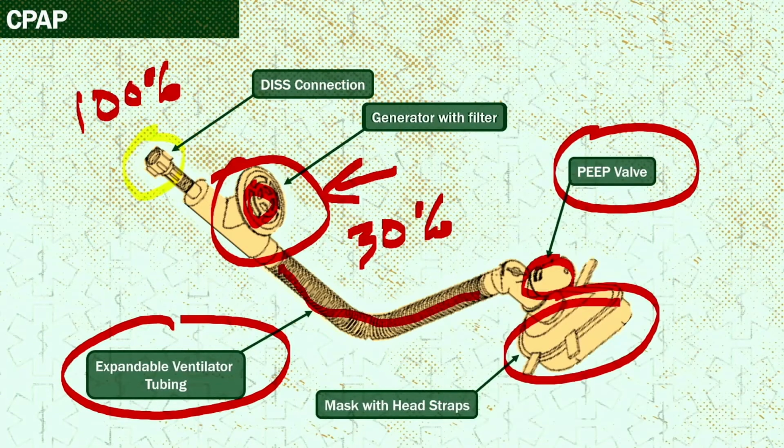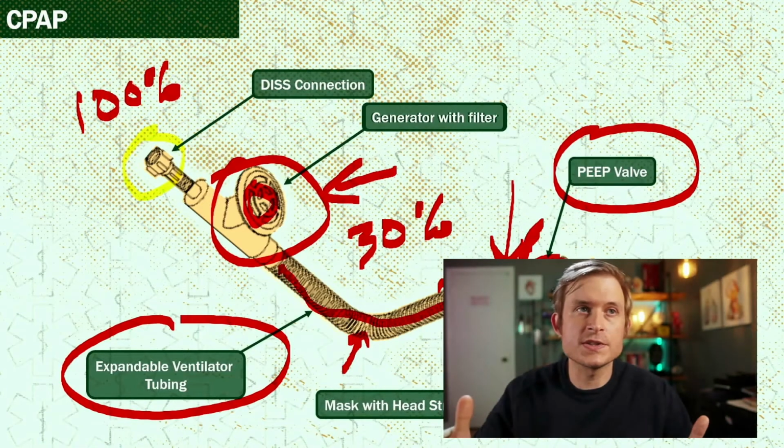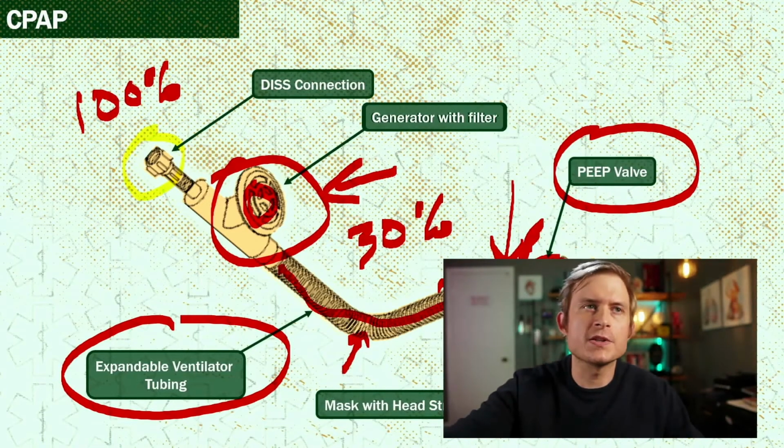There's also an anti-asphyxia valve in here that will allow the patient to breathe through a port on this side of the device when the airflow isn't flowing from the tank. When airflow flows through from the tank, it pushes up a valve here and is directed into the patient's face. When airflow is discontinued from the tank, the valve shuts and allows the patient to breathe air through this vent. Because this mask hooks on very tightly to the face, if this valve wasn't there, the patient could asphyxiate. This is a safety mechanism put in place by the manufacturers.